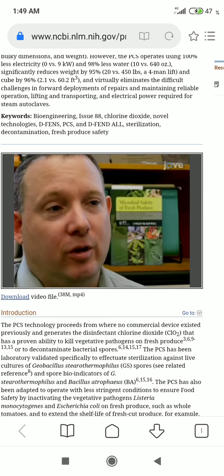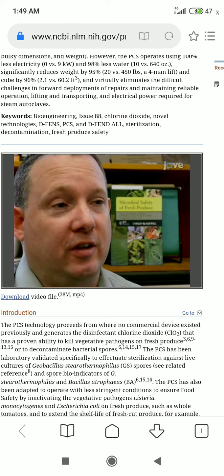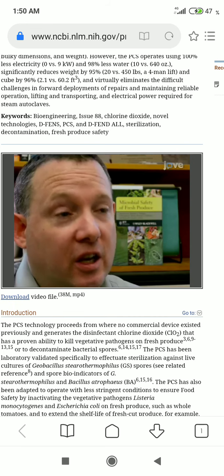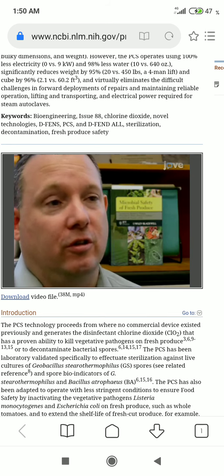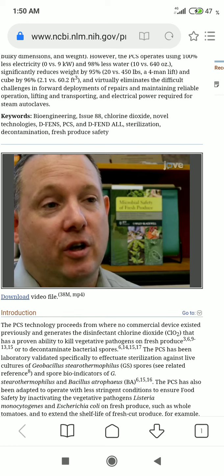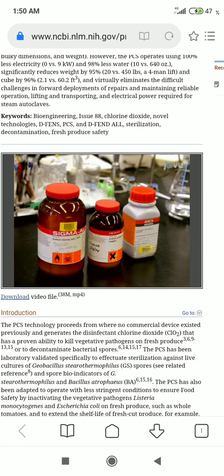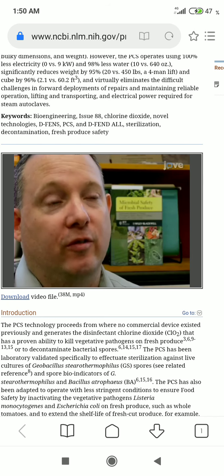The series of chemical systems and inventions that we've just shown all focus on the disinfectant activity of chlorine dioxide. Each one of them can be used for applications such as textile decontamination, cleaning hard surfaces, fresh produce, or surgical instrument sterilization. The microbiological validation procedures we've also shown show just how effective this chemical agent is. And of course, with all chemicals and reagents, remember to handle them safely and appropriately in all laboratory environments at all times.